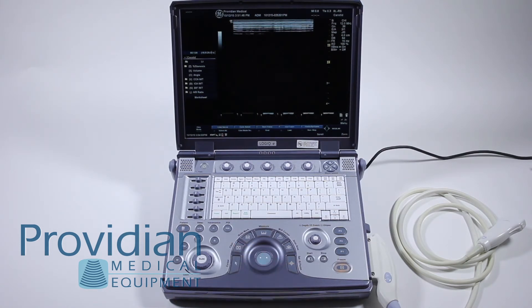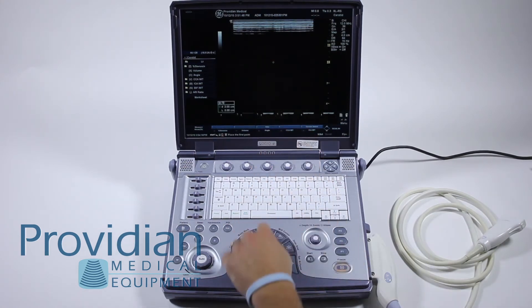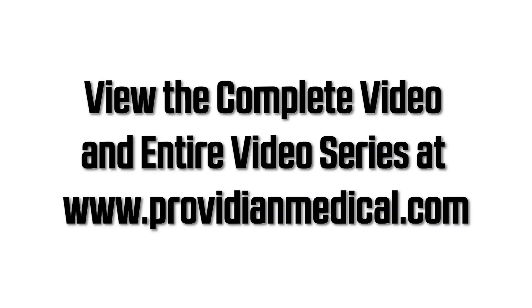Press clear to delete that. For a trace, press measure twice — first you have your cursor, then a little circle appears, meaning you're going to be tracing. You'll get a dotted line to make your trace. If you don't like the measurement you made, you can use the ellipse key to backspace.